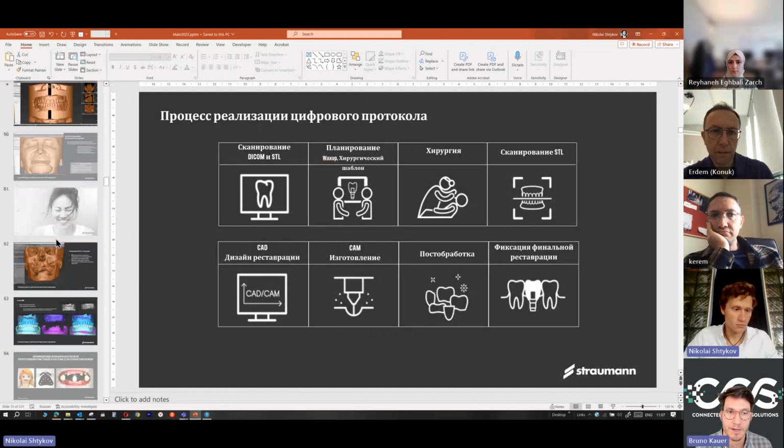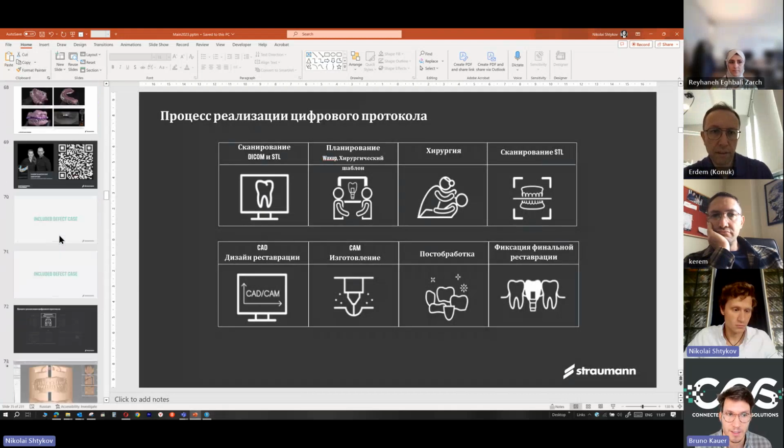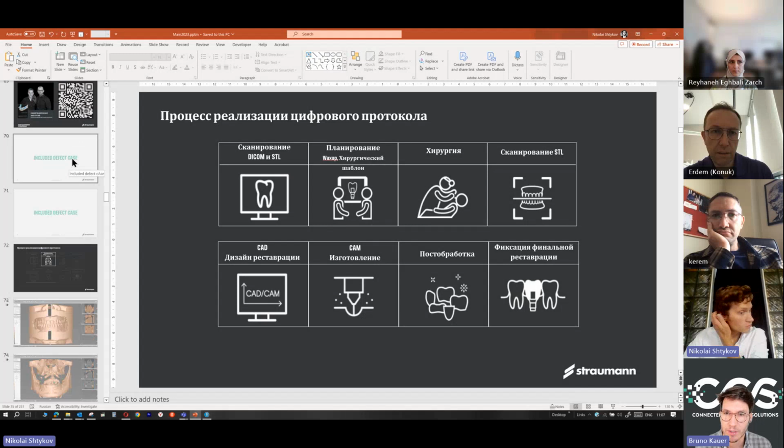I have a quick question, Ellen and Karen. So your cases, you design on CoDiagnostiX, you also have the printer, you have all the workflow, or you outsource parts of it?